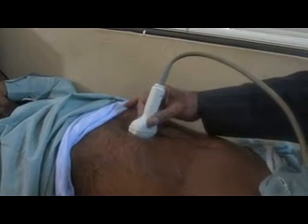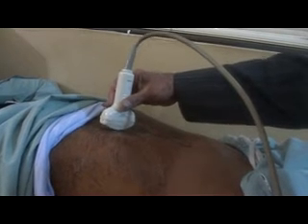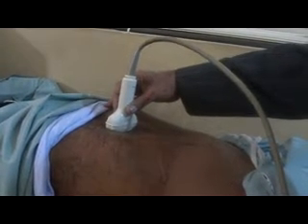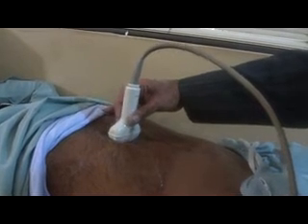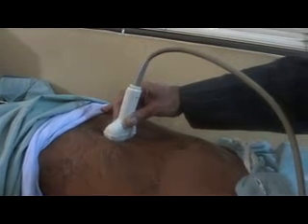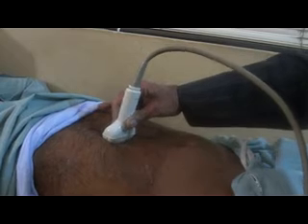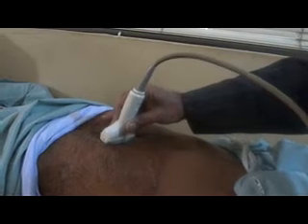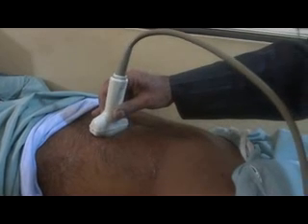At times you may have to come down to the level of the seventh or sixth intercostal space. So this is from where we started — I got a glimpse of the portal vein in this region, then followed it into the liver in the intercostal space, pivoting and coming down into the lower intercostal space. And in this location, see what I am seeing — see the portal vein.